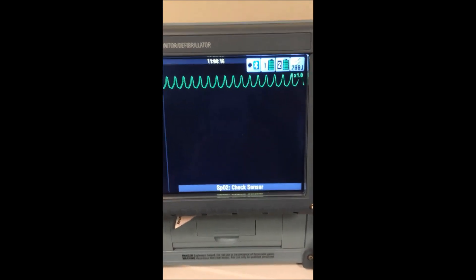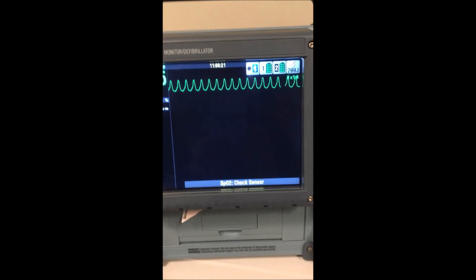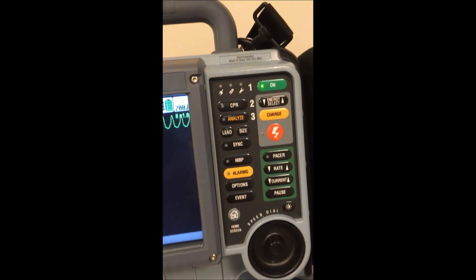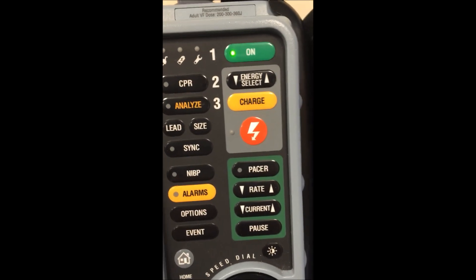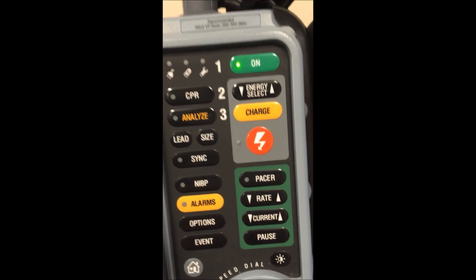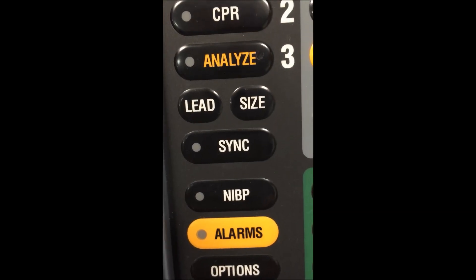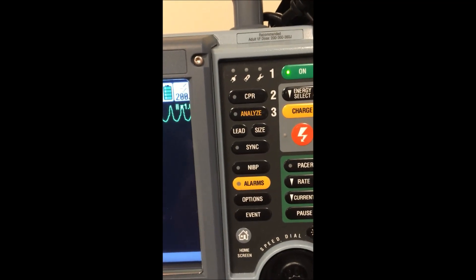To cardiovert this gentleman, what we're actually doing is sending energy in — or trying to send energy in — right at a particular point on the QRS. And what we're actually more trying to do is avoid the T-wave. You can see that we have the on button, energy select, charge, and the big lightning button, which is where we fire the charge into the paddles. And right beside there, we have a switch called sync.